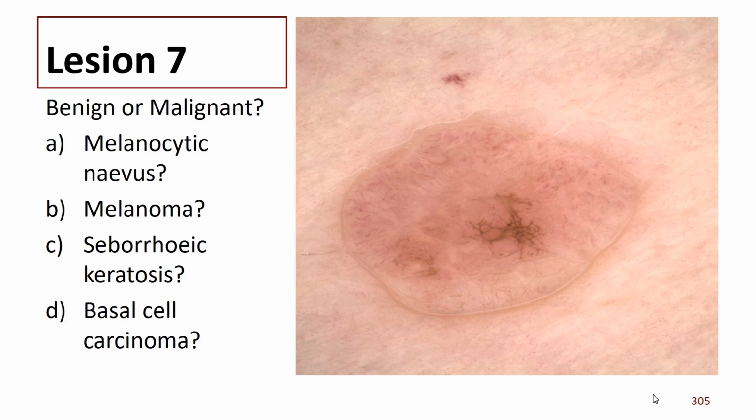"This one, doctor, this one," they say, when you're looking on the other side. You know, like you look at the good ear before you look at the bad ear. Same in dermoscopy. Look at the normal before you look at the abnormal, because otherwise you're going to preconceive what you're going to do. Look at what's normal first. And then you may find that the one the patient's concerned about is also normal. It's just bigger or darker or some other characteristic that doesn't matter.